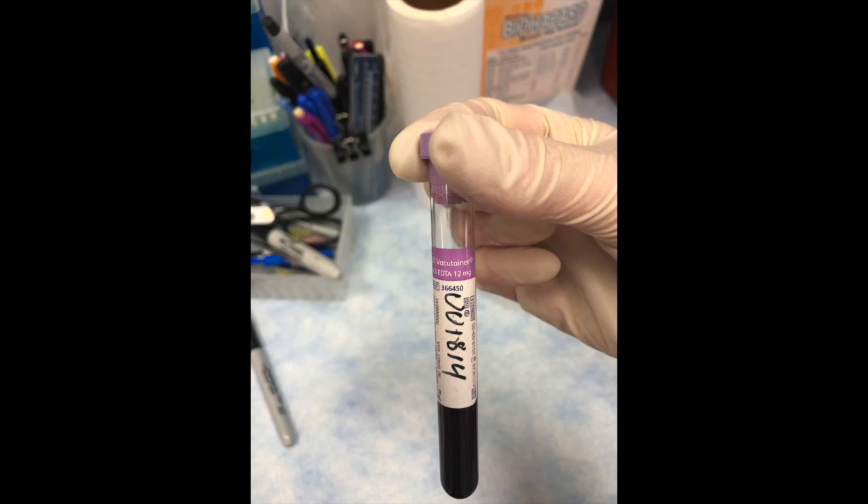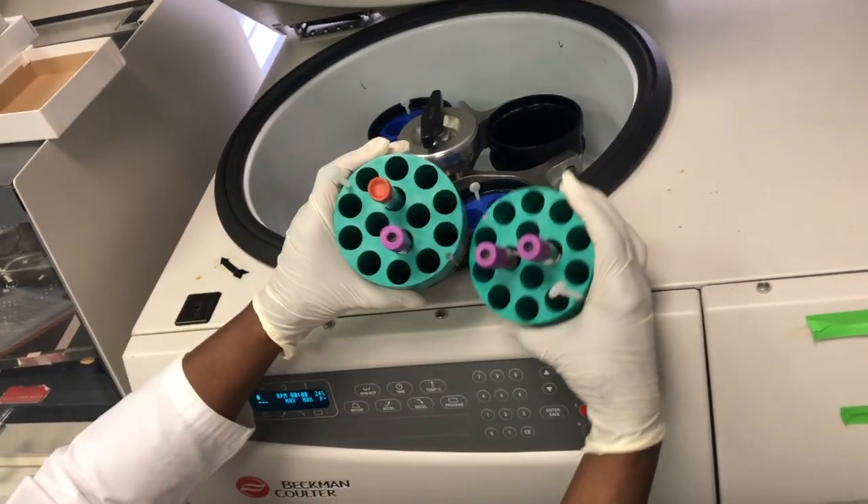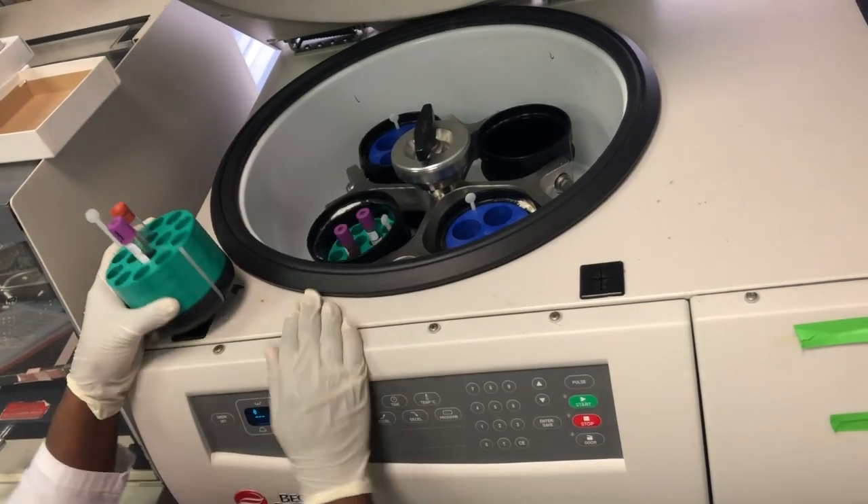14 milliliters of blood will be drawn for genetic analysis using blood collection tubes with K3 EDTA, typically purple top. The purple tops will be spun at 2,500 rotations per minute for 5 minutes in a balanced centrifuge.